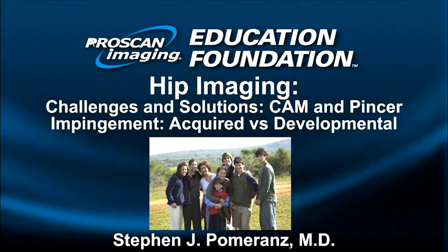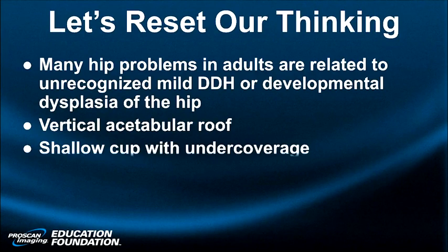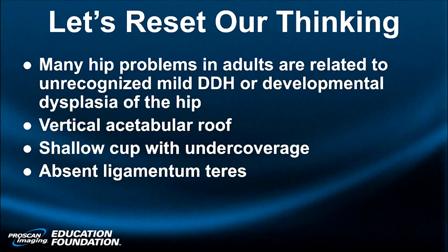Okay, I'd like to do a little bit of re-review on the hip, because that is the most difficult subject in orthopedic MRI. Not that big a joint, carrying a huge area, ball and socket joint, and I find that most people have difficulty understanding the concepts of impingement.